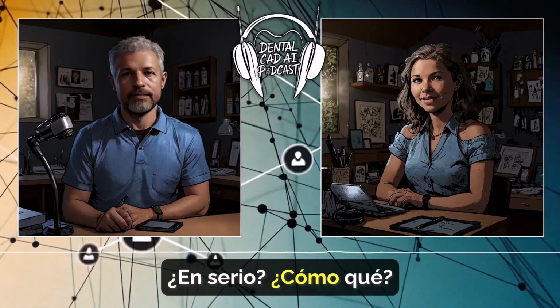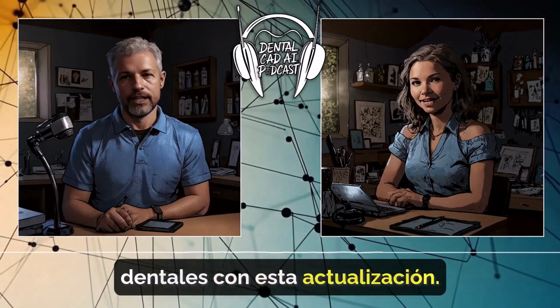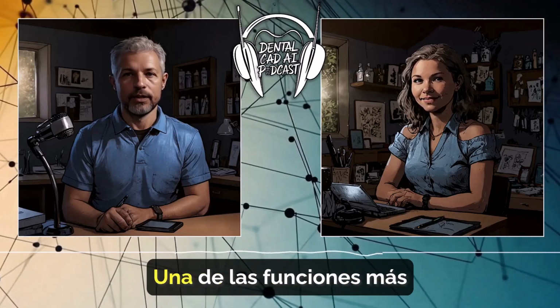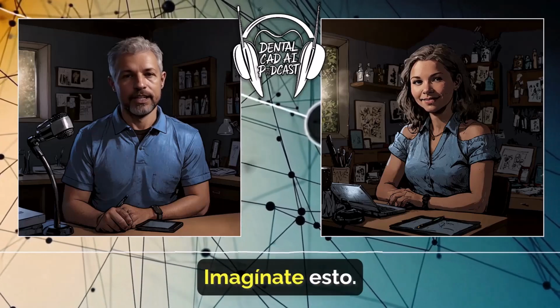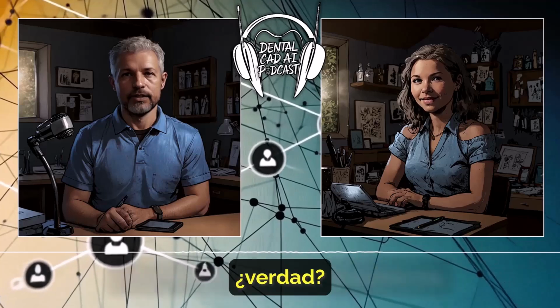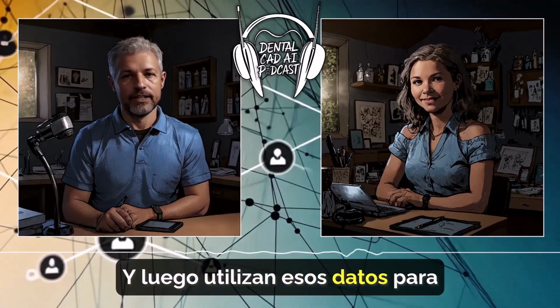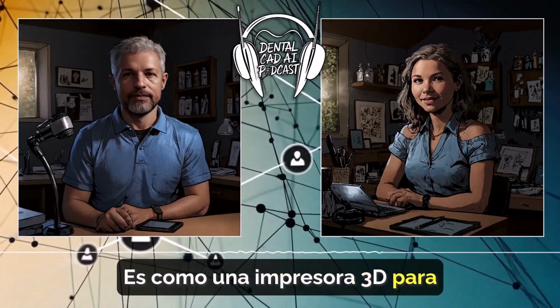Oh, really? Like what? They've really revolutionized how dentures are made with this update. Oh, wow. Okay, tell me about it. So one of the coolest features is called a copy denture workflow. Okay. Imagine this. They scan your existing dentures. Right. And then they use that data to automatically design a brand new set. Oh, wow. So it's like a 3D printer for dentures.